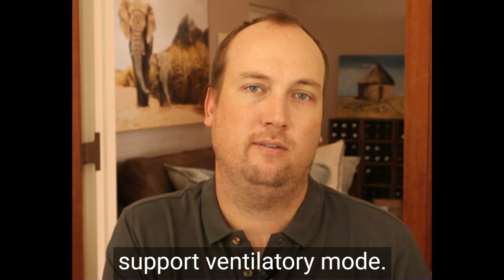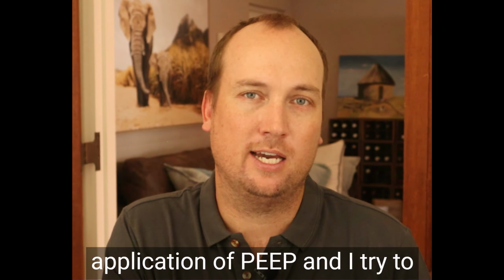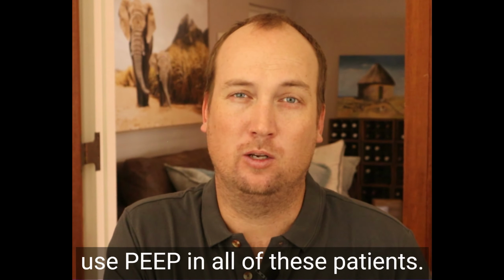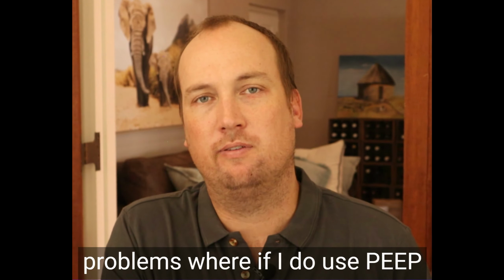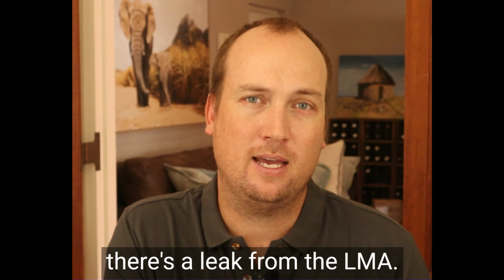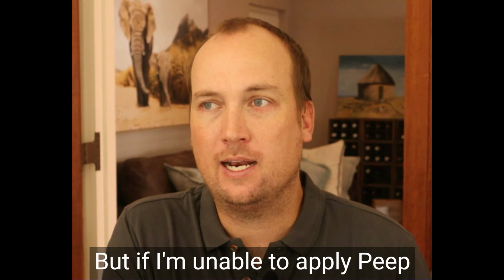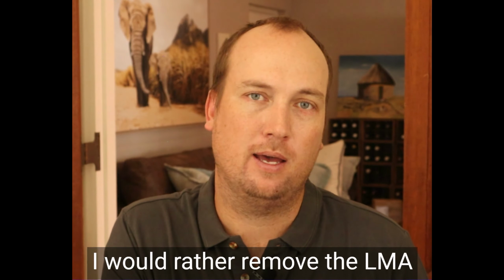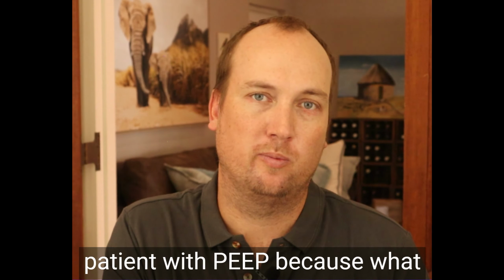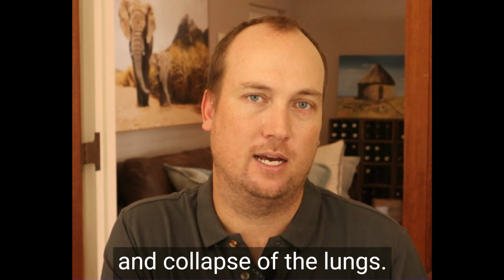In my book, ventilating patients with an LMA still requires the application of PEEP, and I try to use PEEP in all of these patients. I do sometimes come across problems where if I do use PEEP, there's a leak from the LMA, and for short cases then I may turn the PEEP off. But if I'm unable to apply PEEP and it's a slightly longer case, then I would rather remove the LMA and intubate and ventilate the patient with PEEP, because what I don't want is de-recruitment and collapse of the lungs.